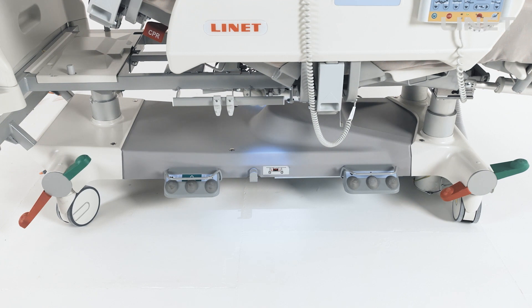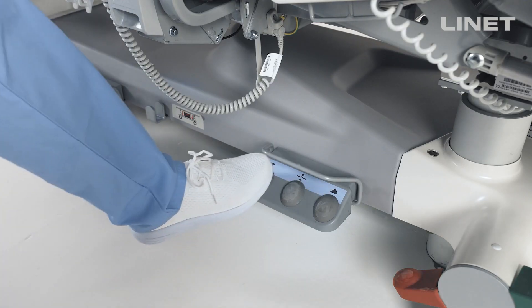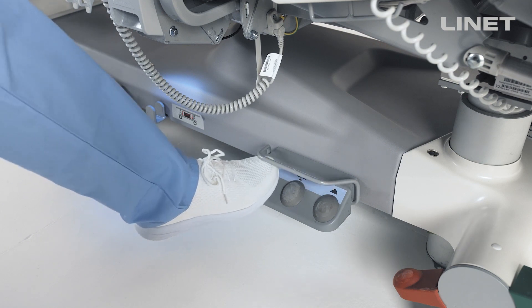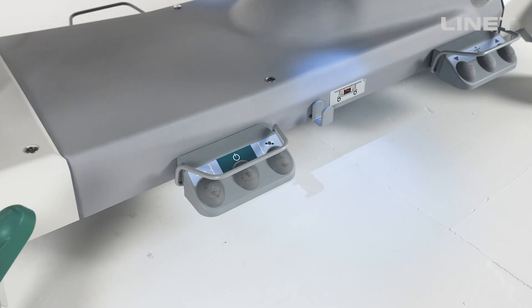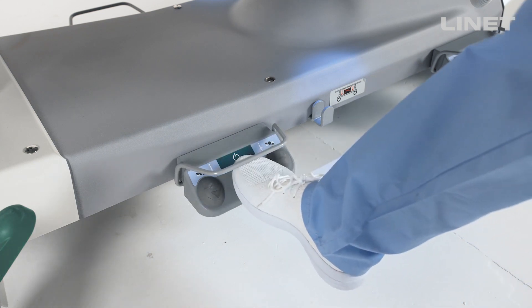There are two types of foot controls. There is one with height adjustment and an examination position button in the middle. The second one operates with lateral tilt, with a go button in the middle.